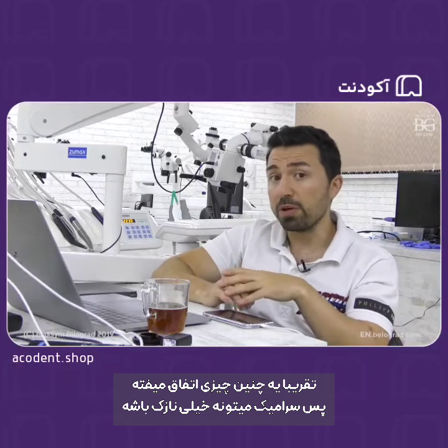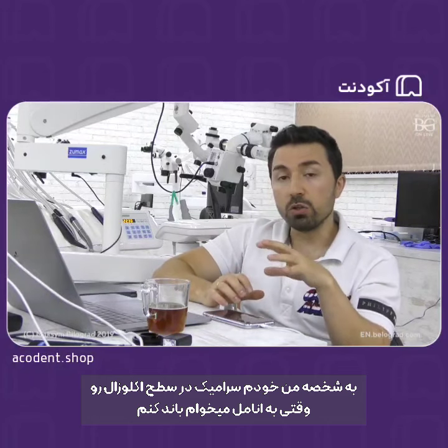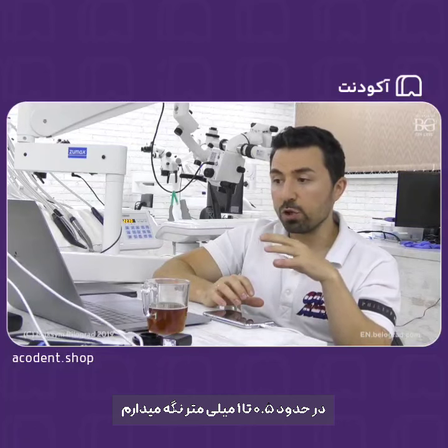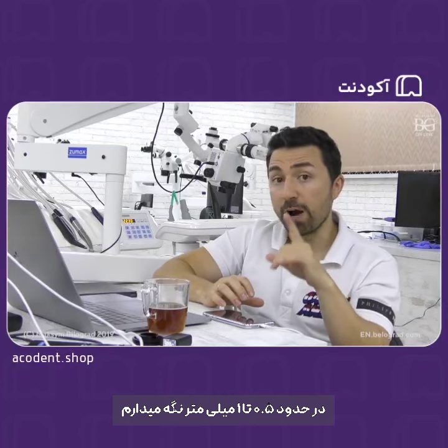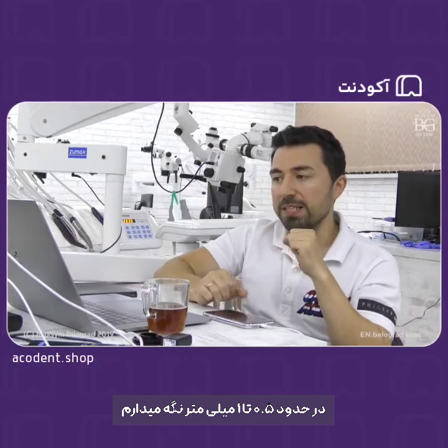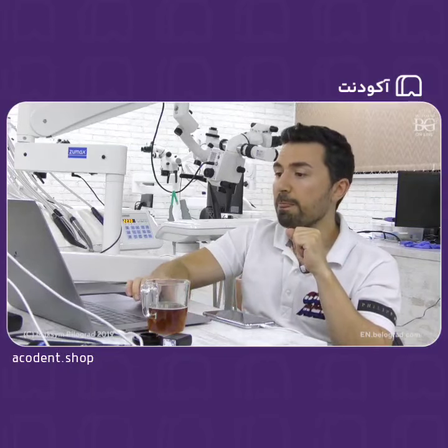So it can be pretty thin. Personally, when I bond ceramic to enamel on an occlusal surface, I try to keep it from 0.5 to 1 millimeter. With 1 millimeter, I feel more confident.